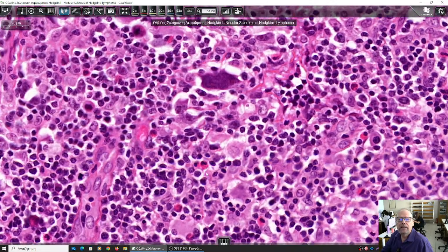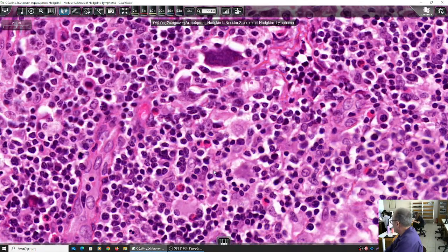I'm sure you can identify them, because if you don't, I'll have to annul the practical exam grade. I will not take them into account, and next Tuesday we will do both exams: the first 3 laboratories and the rest 5. We'll have all the exams. So please tell me, what are these cells here? I'm sure you know them.